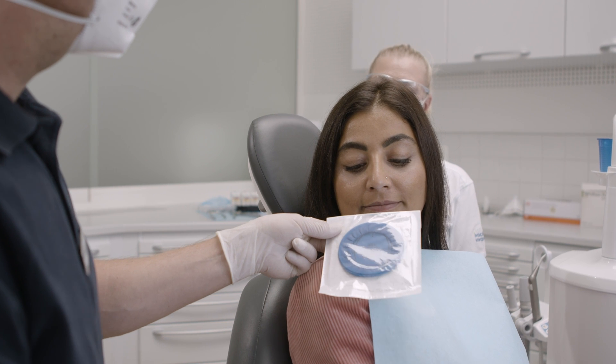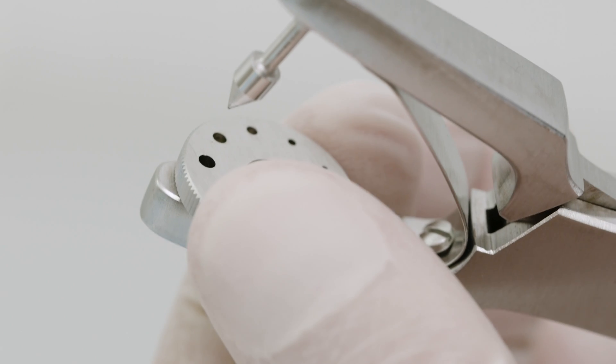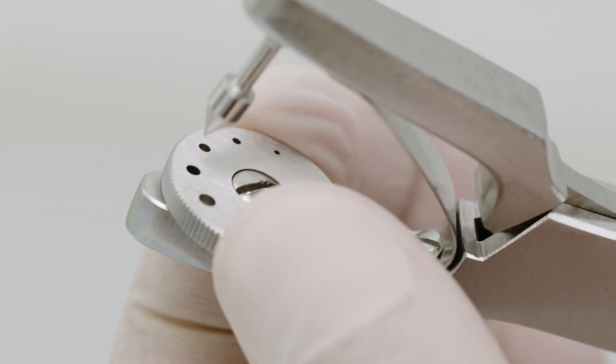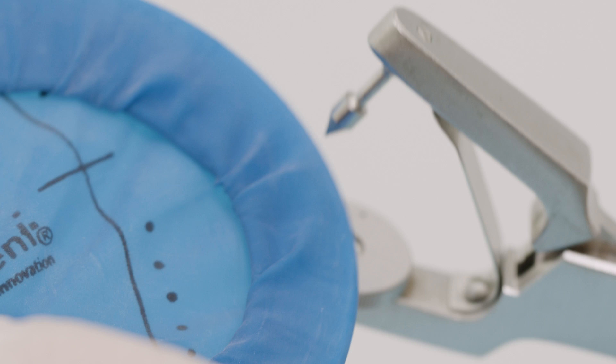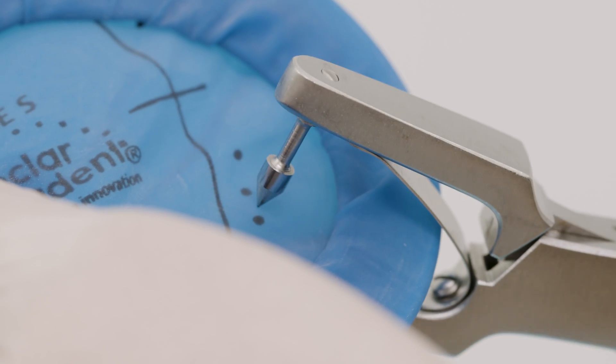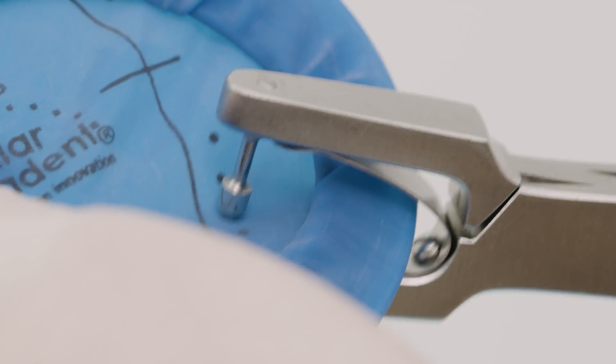Select the suitable size of Optradam before the treatment. The rubber dam punch is used to make the appropriate holes, depending on the teeth to be exposed. Optradam has markings on its surface to facilitate the perforation.